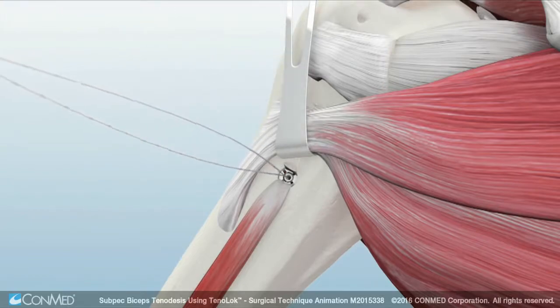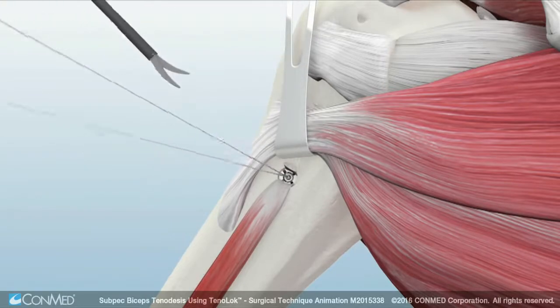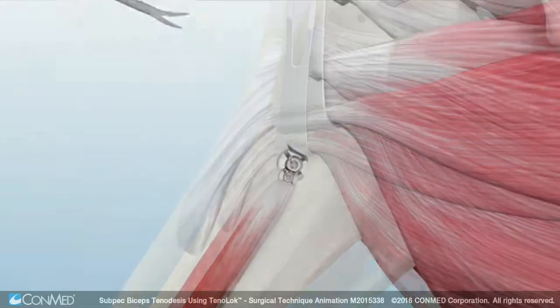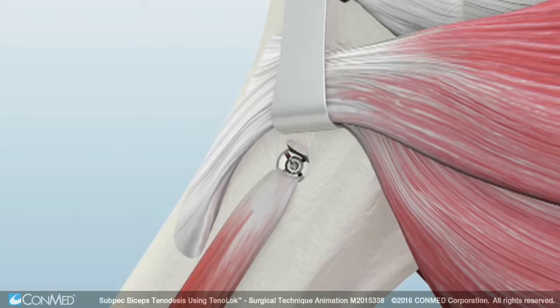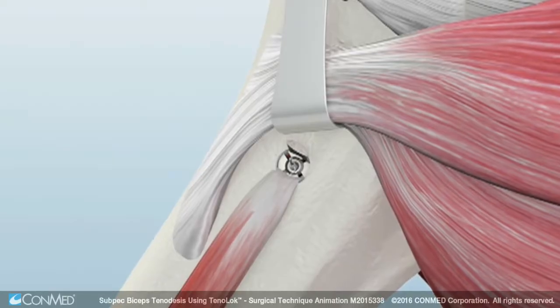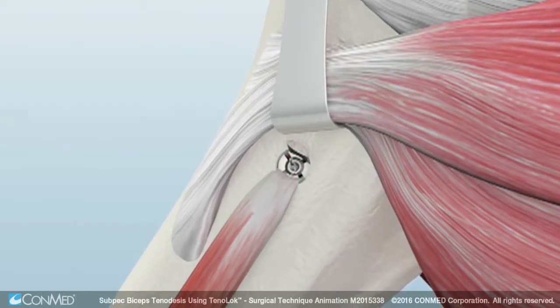Multiple half hitches can be tied. Then cut the remaining suture. The final construct shows the biceps tendon implanted into the humerus and on both sides of the Tenoloc dual expanding tenodesis anchor.